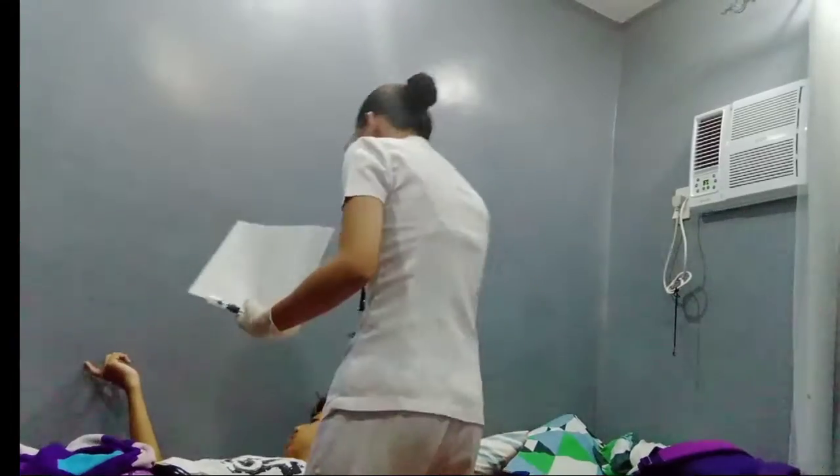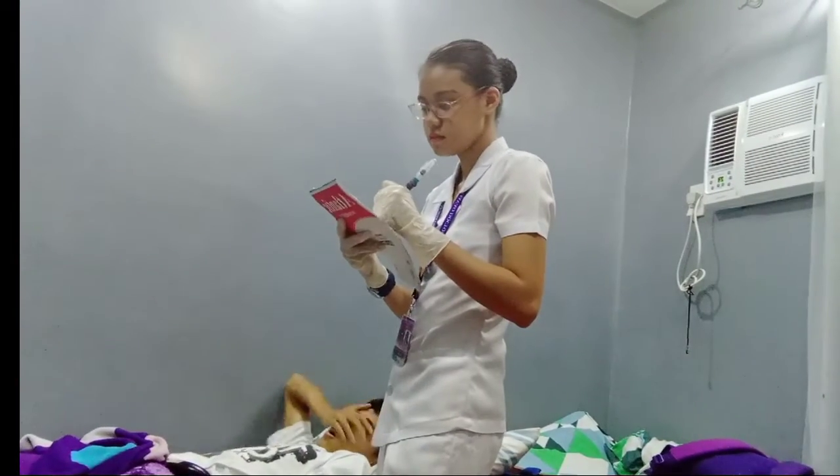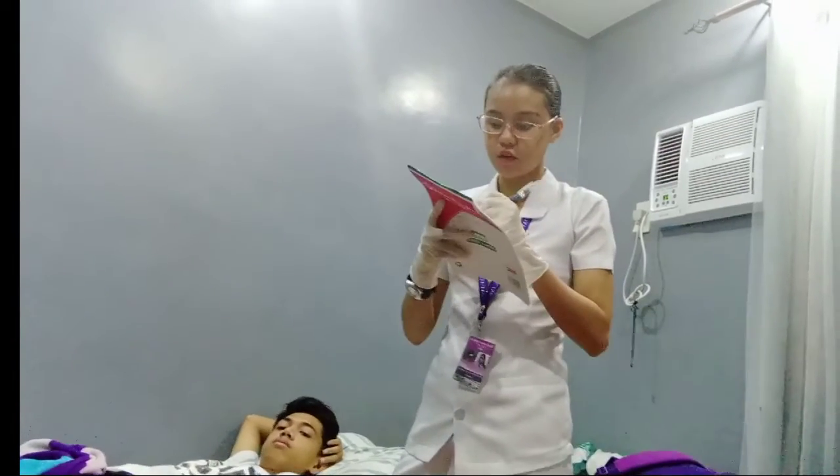Okay, so Hazli, are you in a comfortable position? Yes. So, okay, time is 4 a.m. Now let's move forward to the intramuscular injection.